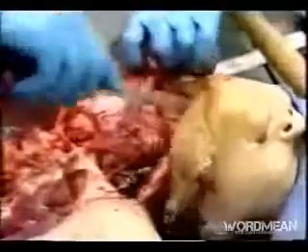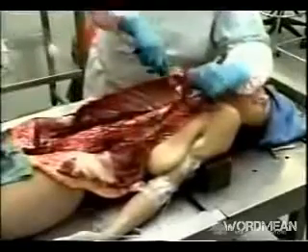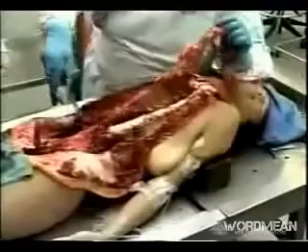He's going to free up all of the tissues through to the base of the tongue, and then dissect down along either side so that the neck organs can be removed along with the tongue. Now that he's down in the upper chest, he can transect them because that leaves enough room to infuse embalming fluid through those vessels down low.